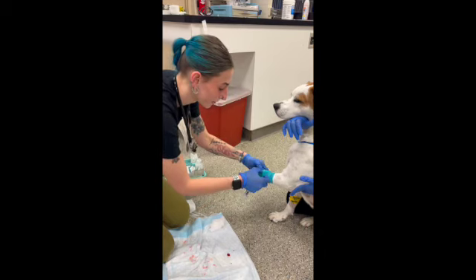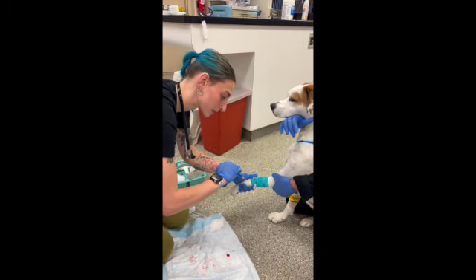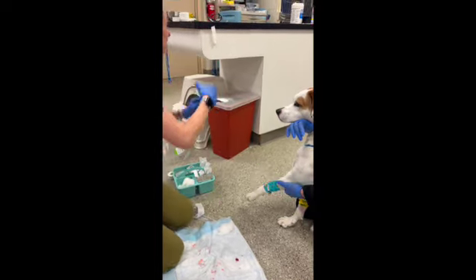And then once it's wrapped, I usually like to give it one more flush and have our holder check it one more time to make sure it hasn't moved after we wrapped it. All right, she said it's good, so now we will just clamp it off and then date and time it.